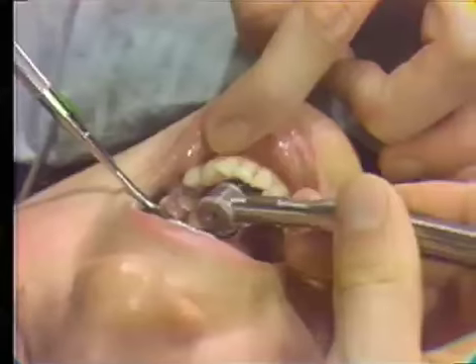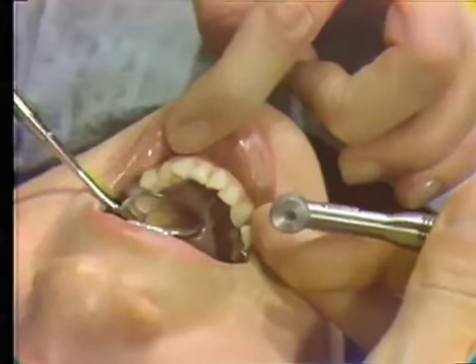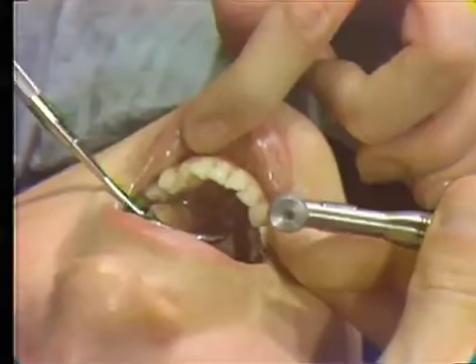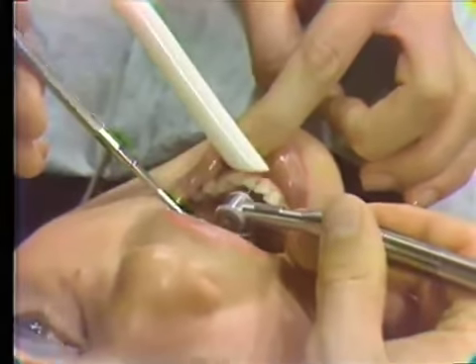A finger rest can be established on the buccal surfaces of the mandibular right premolar teeth. The evacuator tip is placed labial to the tooth being treated with the opening oriented toward the head of the handpiece.